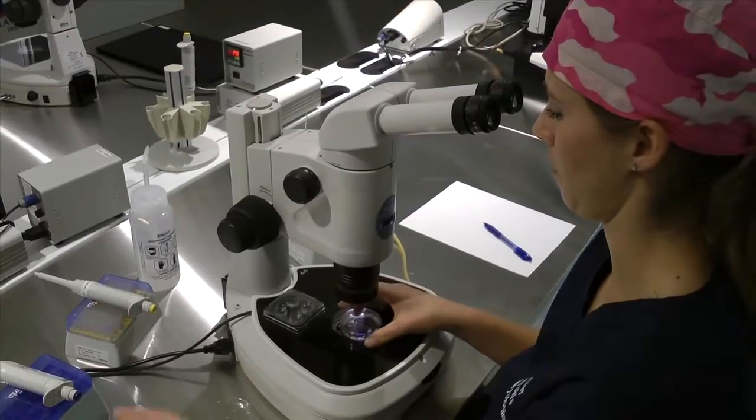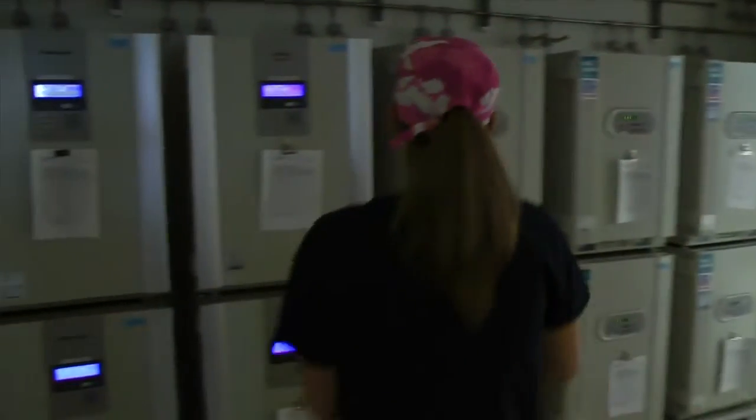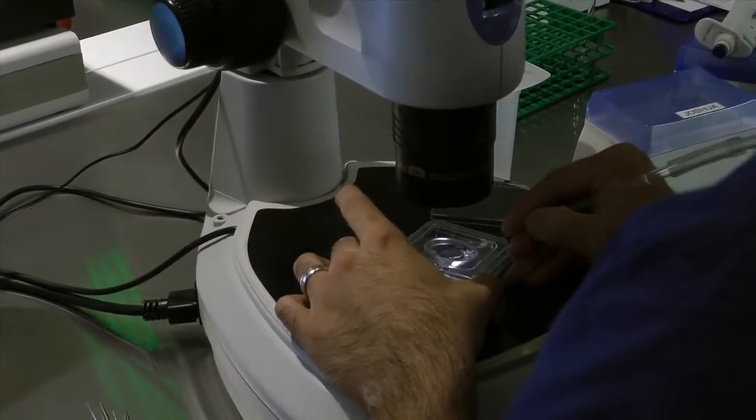In our industry, one of the criticisms about the mouse embryo assay is that it hasn't been standardized, and there's the possibility for variation in the results, potentially between laboratories or between investigators, because of the setup or the design of the assay. As far as the release of products, a MEA assay is required for the release of finished products, and that lends itself to some question about quality, as quality can vary, and depending on the sensitivity of the assay, that toxicity or lack of quality or inconsistency in quality might not be picked up.